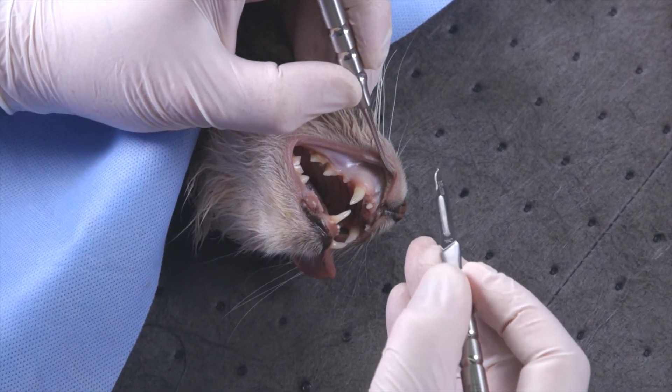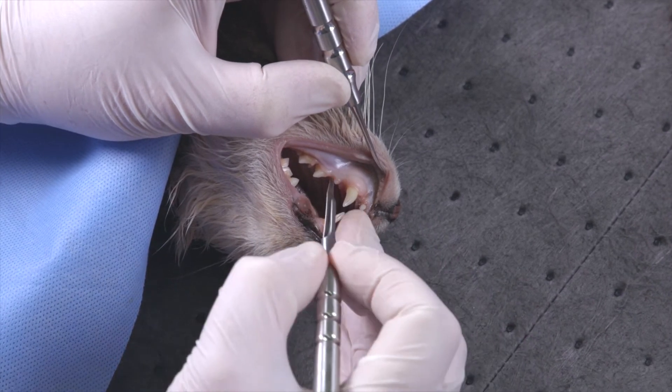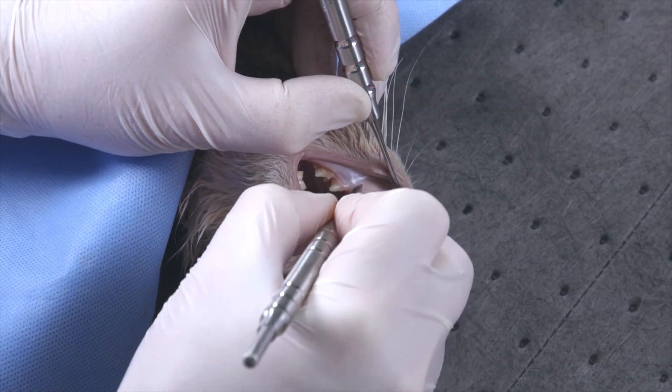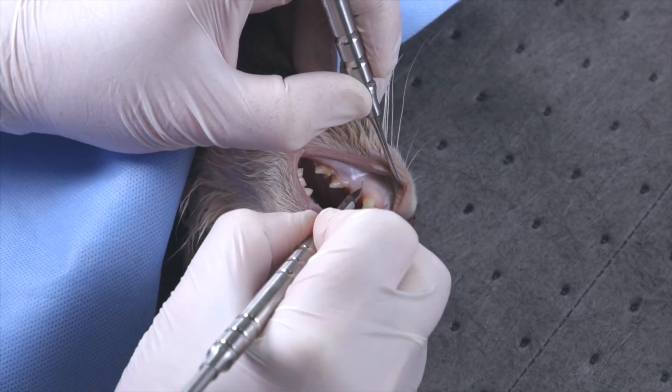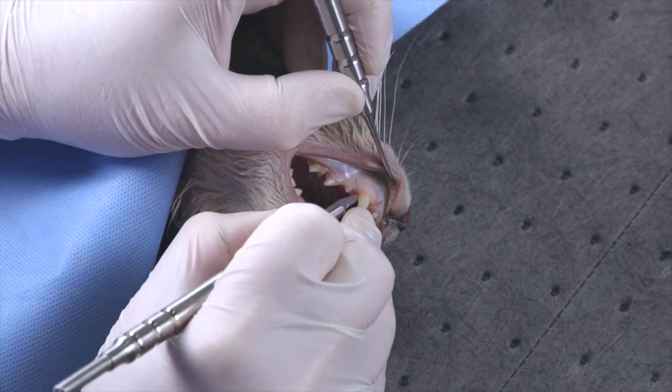Because I'm using this round handle, I can be so much more precise with the incisions — starting above the mucogingival junction, cutting boldly down to the bone with one cut, ending at the distal aspect of the tooth and stabbing in at the very end.